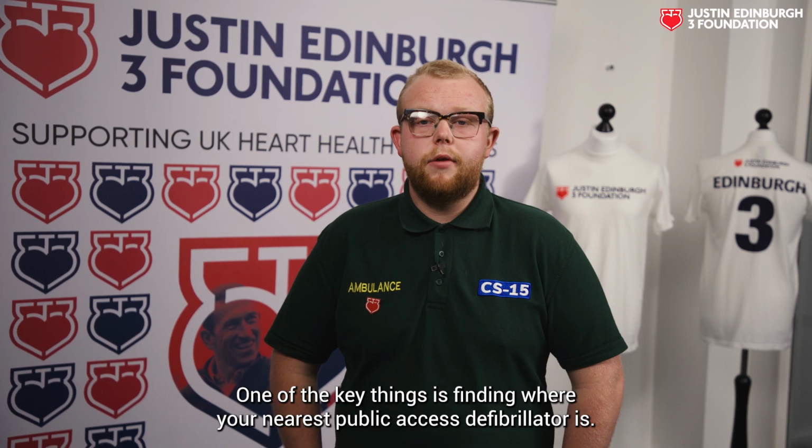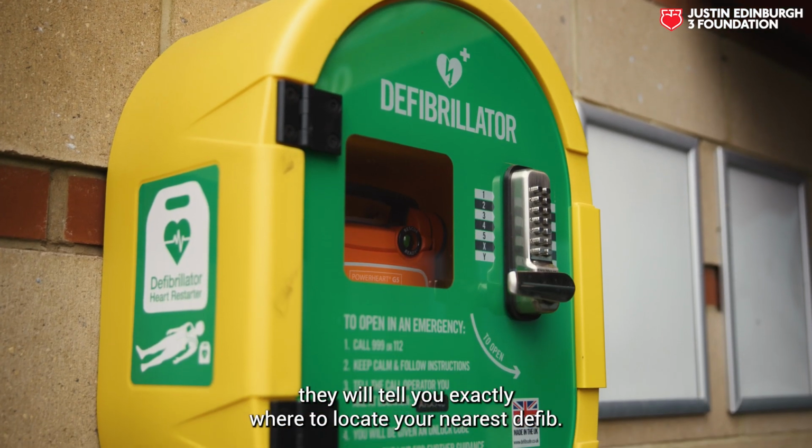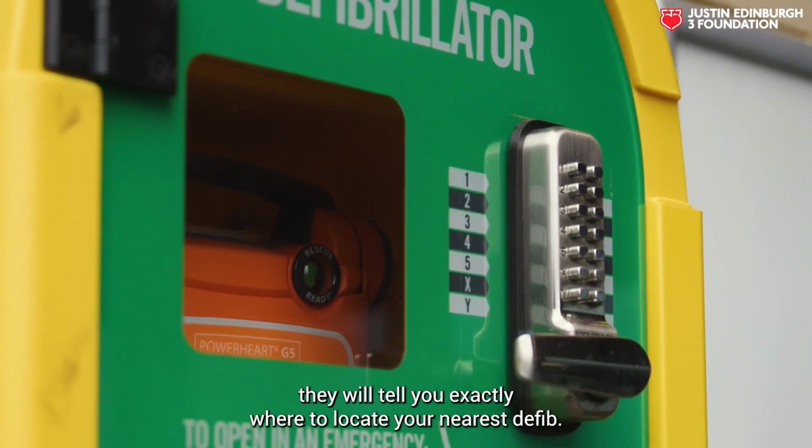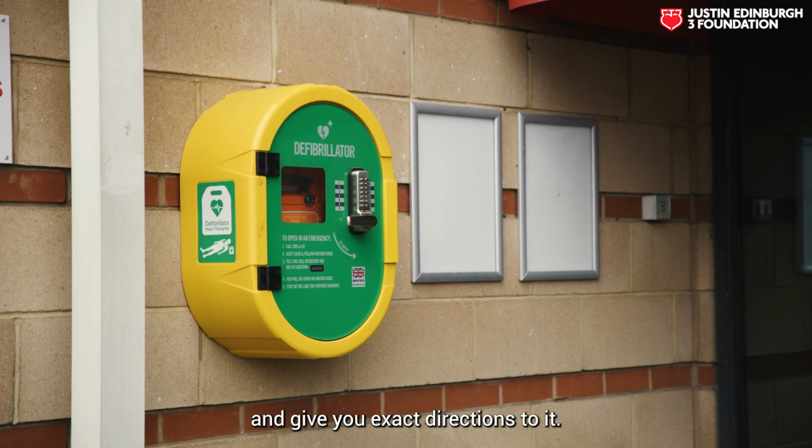One of the key things is finding where your nearest public access defibrillator is. Don't stress about this. When you call the ambulance service, they will tell you exactly where to locate your nearest defib. They will also have the passcode for any locked cabinets and give you exact directions to it.